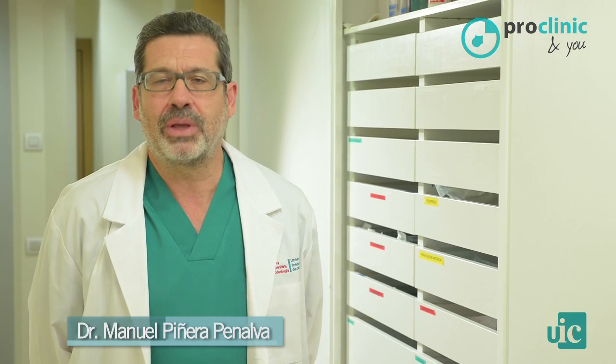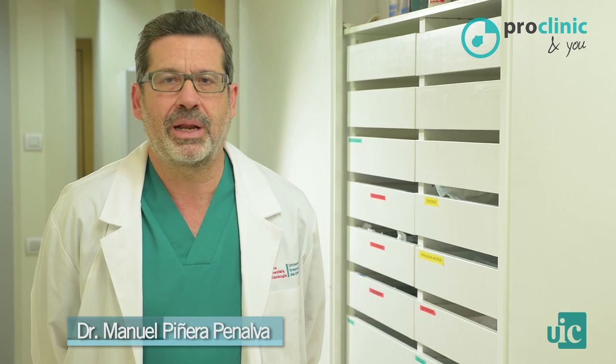Tooth extraction is the most common surgical procedure in dentistry. It is, as its name suggests, the removal of a tooth from its natural place in the dental alveolus.